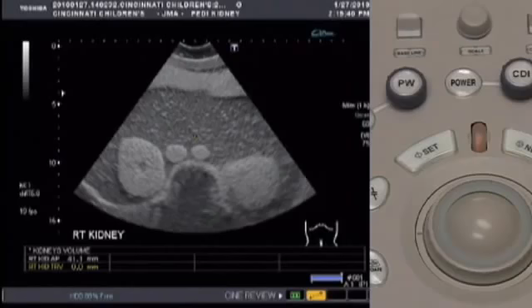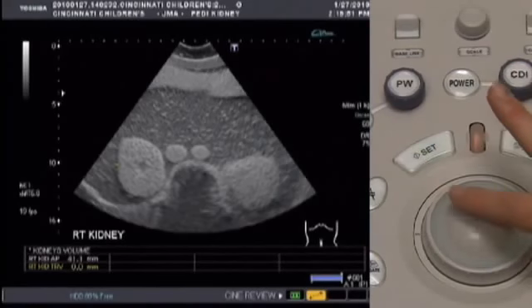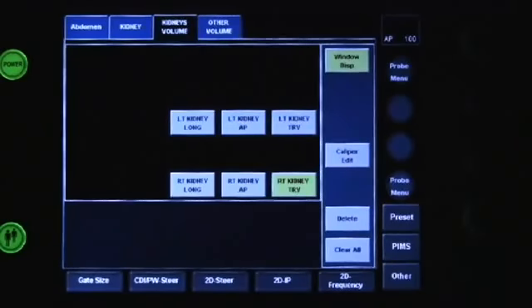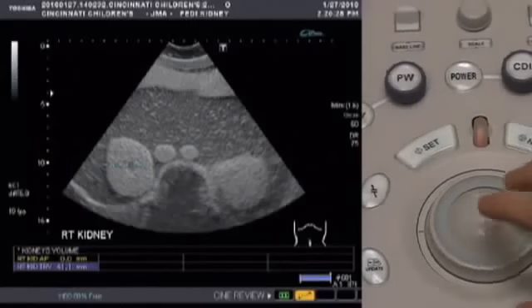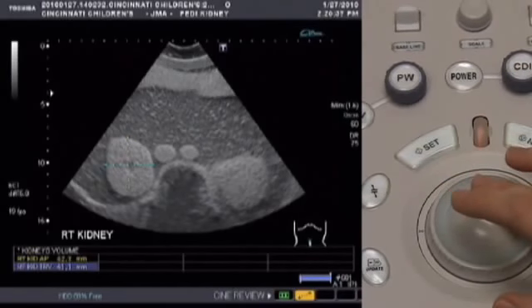Use the trackball just like when measuring with the caliper: move the cursor to one edge of the object and press set to mark that edge. Use the trackball to move the cursor to the other edge and press set again. Then we'll measure the AP length of the kidney — choose that label on the touch screen. Use the trackball to move the cursor to the appropriate edge and press set to mark it. Move the trackball to the other edge and press set again.